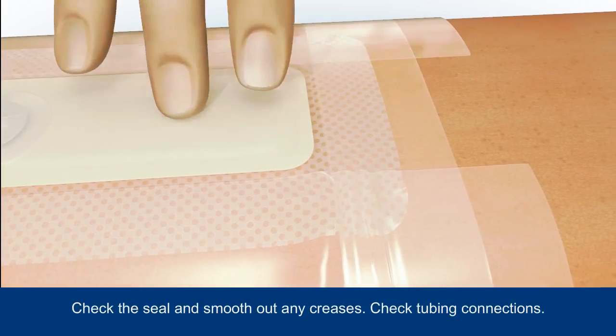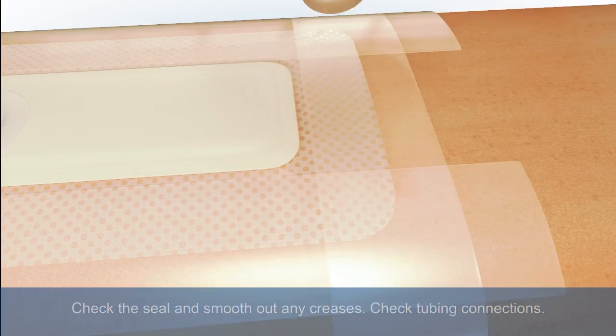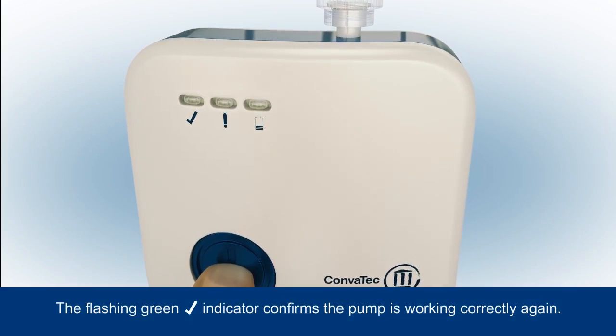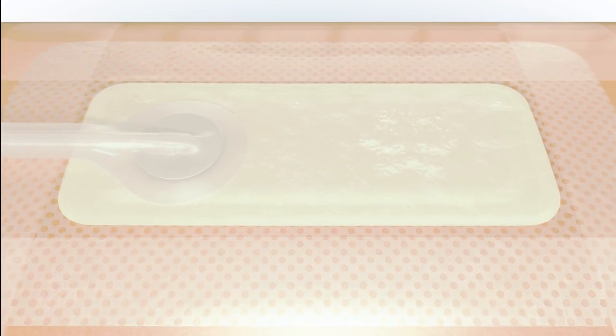Ensure you check the dressing seal and smooth out any creases, and check the tubing connections are secure. Press the blue button for 3 seconds to resume therapy. The green tick indicator will then begin to flash as therapy is successfully restarted.